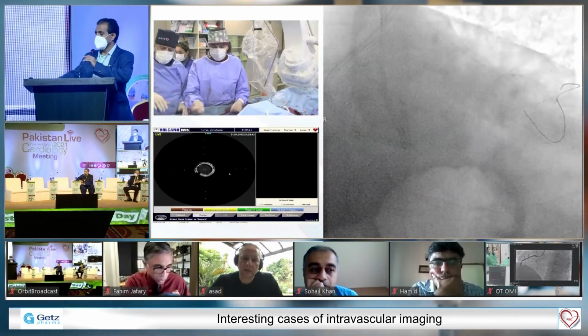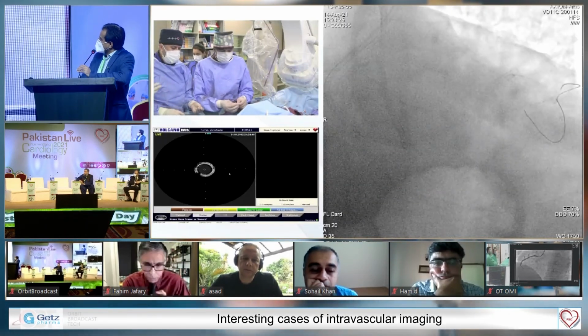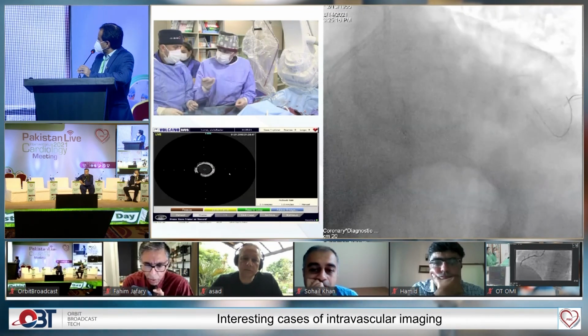I will take the 3.5. I will do 3.20, okay. I will post-dilate that and see, yes?